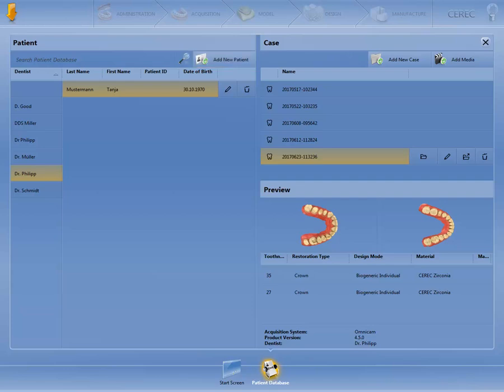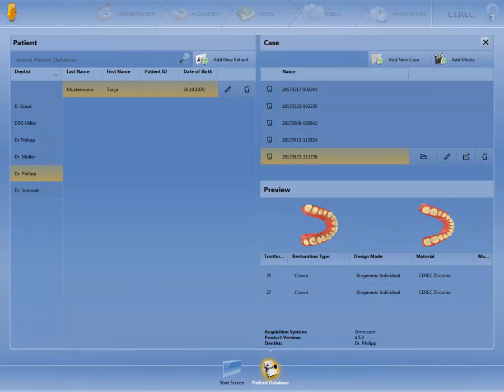Multiple cases can be assigned to each patient. These are located in the case area. Click on Open Case if you wish to open the case highlighted in orange.